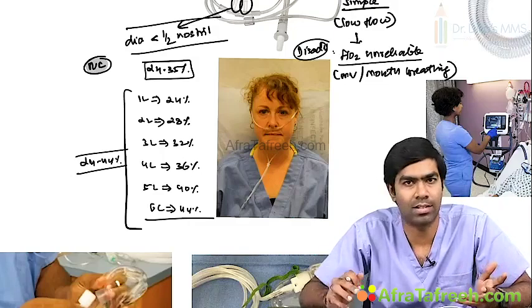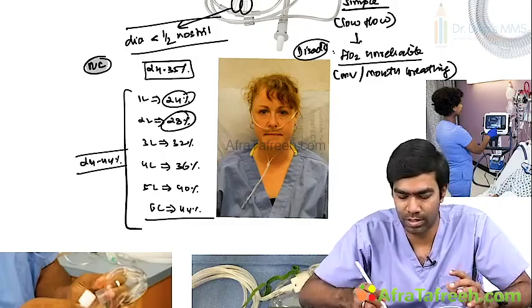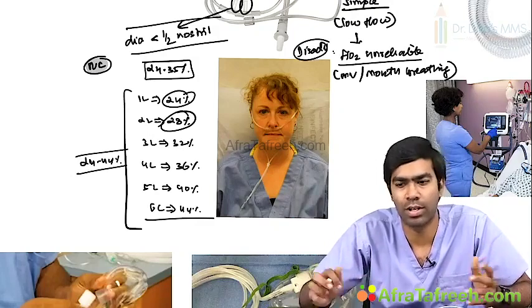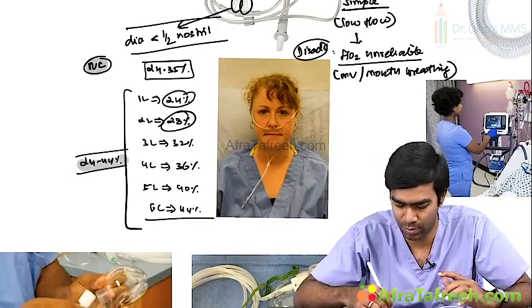So many factors determine the oxygen delivery, the FiO2 delivery, of this particular device. So I don't really trust that it produces a fixed FiO2 like this. It itself is wrong in the first place in the context of a low flow device. It's going to deliver a variable FiO2. Just state a range, 24 to 44 or 24 to 35%.